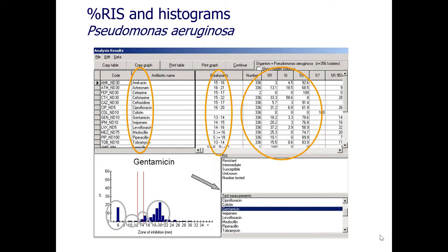A third example: if in the first half of the year they tested ciprofloxacin and the second half levofloxacin, there's not necessarily a bias — the two drugs are so similar for E. coli that the numbers are comparable. If ciprofloxacin resistance at the beginning of the year is 40% and levofloxacin resistance at the end is 30%, there probably isn't a bias — the two drugs are essentially equivalent. Same logic applies to switching from imipenem to meropenem. So if resistance appears to grow when switching between very similar drugs, that may reflect real emergence rather than a methodological artifact.